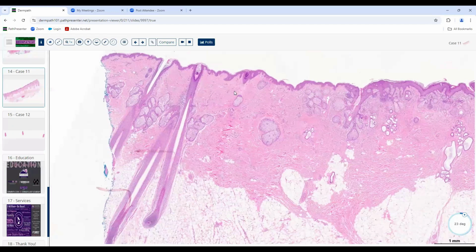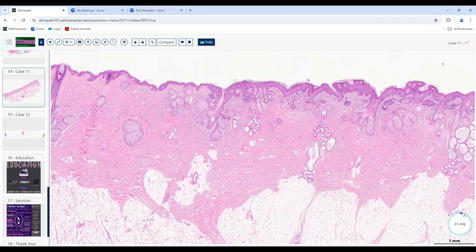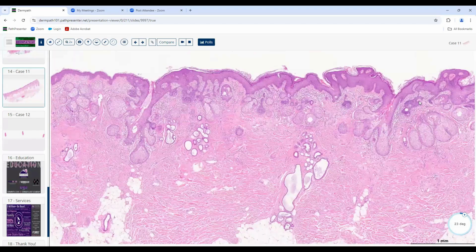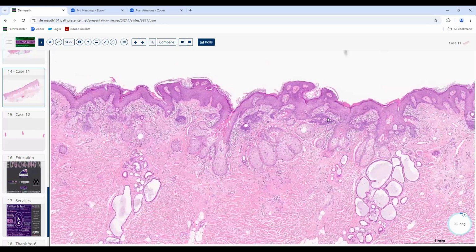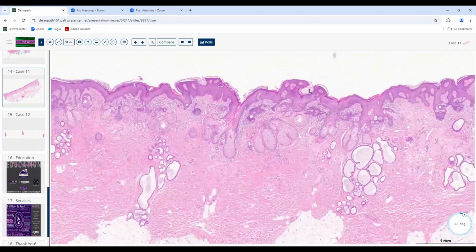So here's where there was hair. Here, there's no hair because the hair has been replaced by these hamartomatous bizarre sebaceous proliferations and these bizarre follicular structures that have formed. And notice also there's this verrucous epithelial hyperplasia. Sometimes you'll get what looks almost like warts, like trichilemmal verrucae, in these lesions. Then there are little verrucous areas there, but these are not really HPV induced.